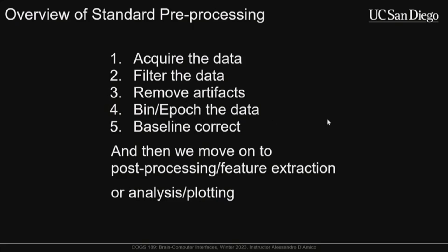We then do this thing called binning, or what a lot of people in the field call epoching. And yes, I know there are many, many ways to pronounce this word, epoching, but most of us say epoch. It's just sort of the standard. So you can use it as a noun or a verb. You can epoch data, or you can look at epochs. And this is essentially just extracting data relative to a certain event. Again, we're focusing on synchronous data. And then we baseline correct, and I'll talk about this later.